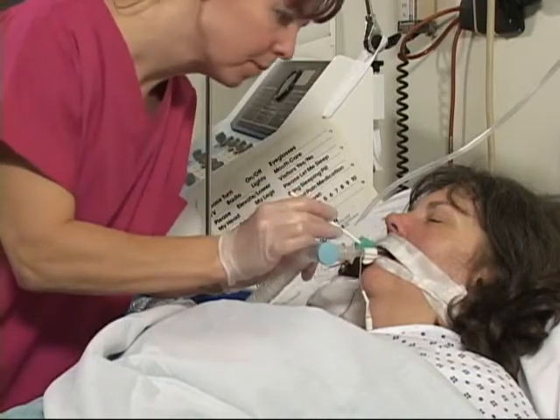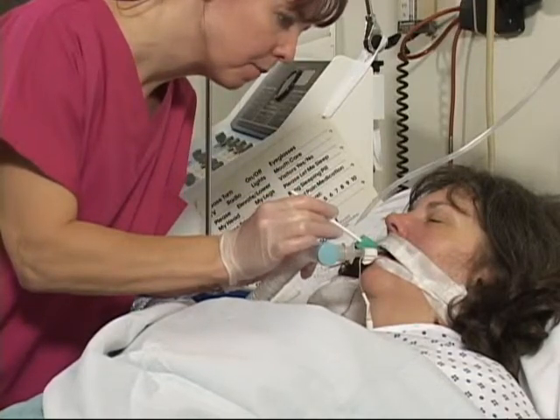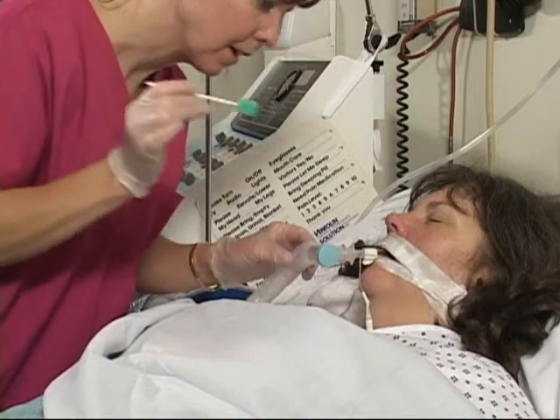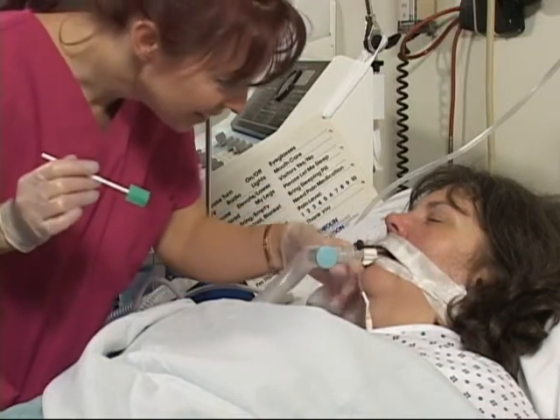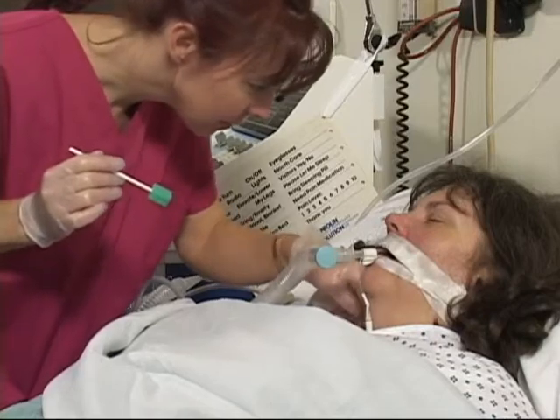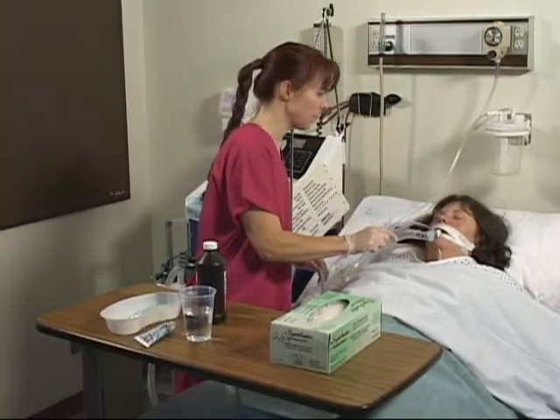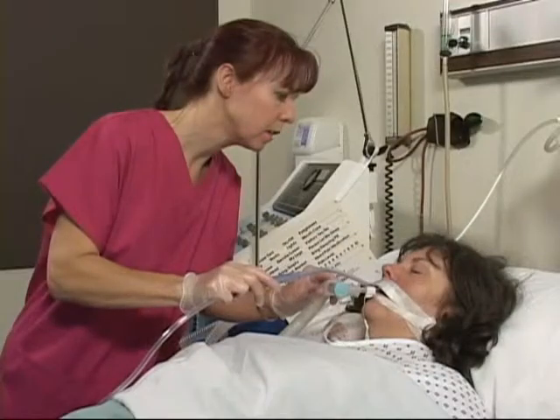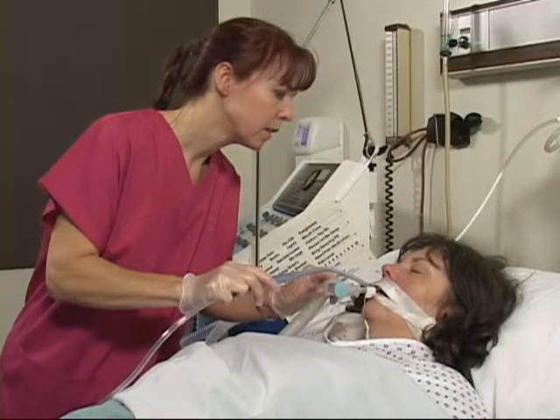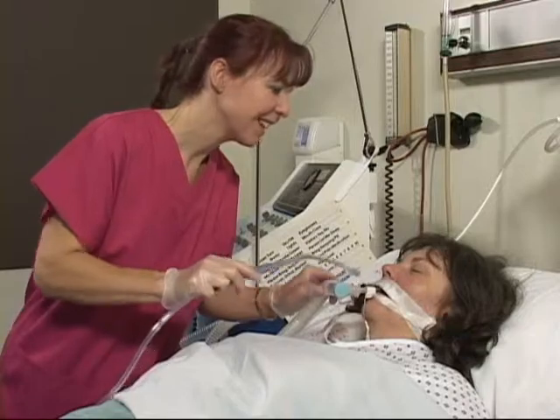Oral hygiene is very important to the client's comfort. Wearing non-sterile gloves and using a soft or foam toothbrush and mild toothpaste is recommended. Use half-strength hydrogen peroxide and mouthwash mixed with water per your facility's protocol. Oral suctioning with an oral suction tip is used to remove dripped liquids from the oral cleaning procedure.